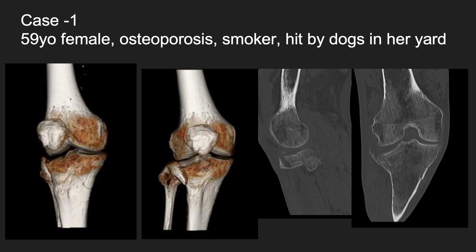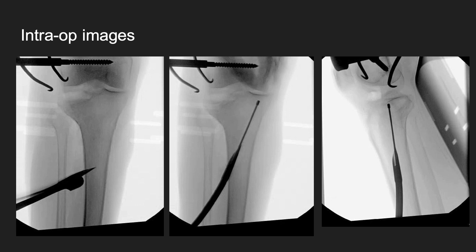Typically prior to using Luminos, this would require lateral plate and screw fixation with possibly a percutaneous plate medially or some other adjunct to support the medial column. Using the Luminos system, you can make a percutaneous incision laterally. I prefer to use the awl. You can use a starting drill to pass the guide wire up into the medial column and get it directly underneath the subchondral bone in that medial column.